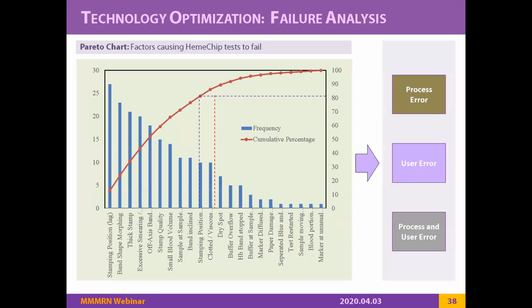So this is what we did at every step. This is kind of like a grand summary, but we did it in every step for the cartridge development, for the reader development, for the software development. We prioritize what we have to solve now, what we can solve later. That's how things started moving.